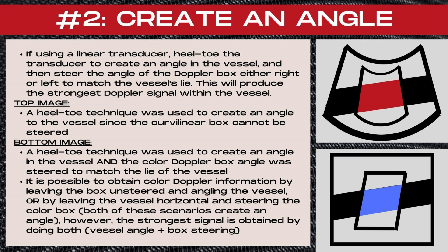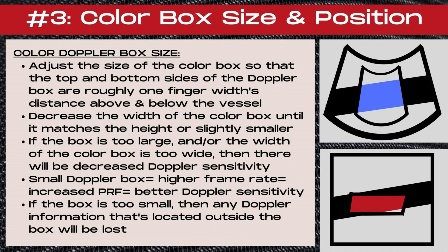It is possible to obtain color Doppler information by leaving the box unsteered — pointing straight down — and angling the vessel itself, or by leaving the vessel horizontal on the screen and steering the color box. Both of these scenarios create an angle. However, the strongest Doppler signal is obtained by doing both techniques: creating an angle with the vessel and steering the box.